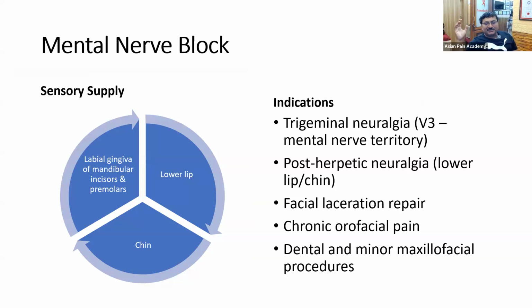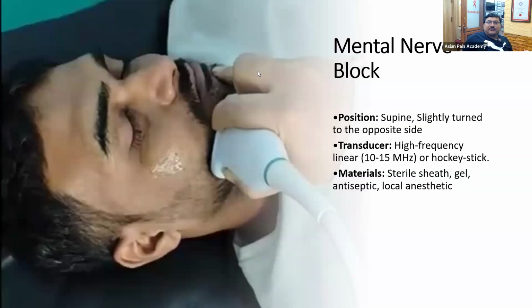And indications are similar, like trigeminal neuralgia involving the mental nerve division area, post-herpetic neuralgia in the lower lip or chin, facial laceration lip repairs, chronic orofacial pain, and dental and maxillofacial procedures. So here you have to block it.